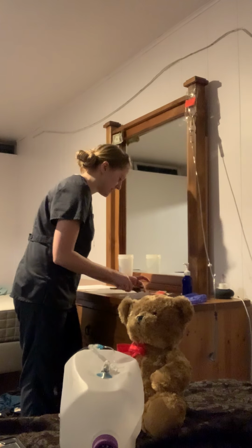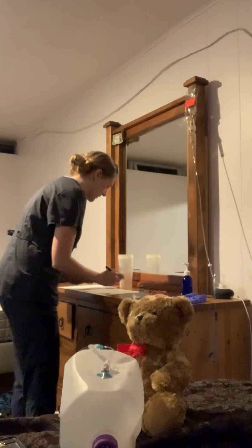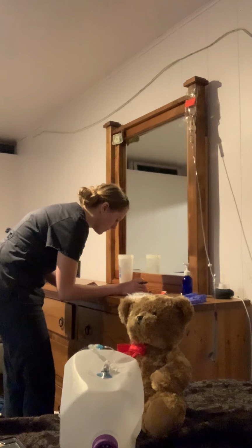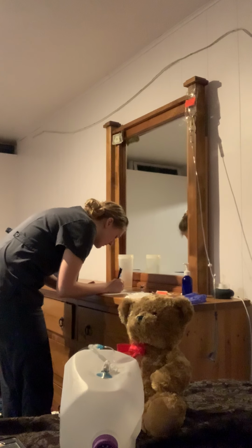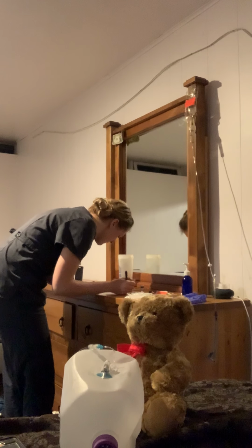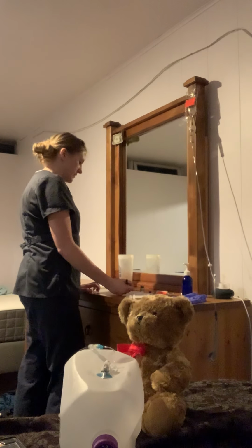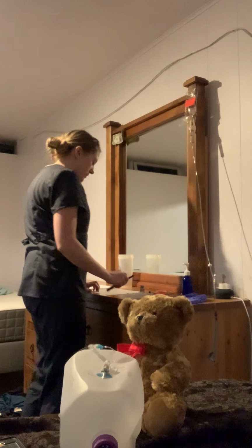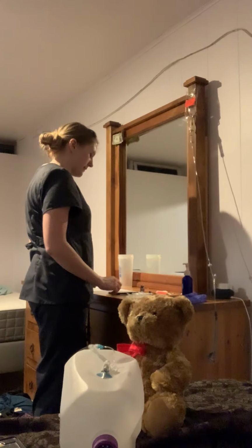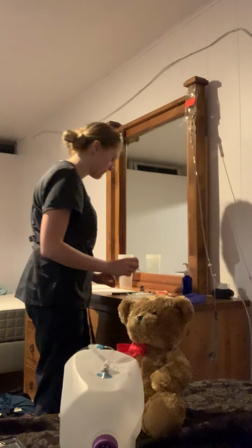So I'm just going to do my dosage calculation here. So order is 40, divided by what's available, 10 milligrams in 1 ml. So that gives us 4 mils. Okay, so that is our first medication check. So the next thing I'm going to be doing now is drawing up the medication.